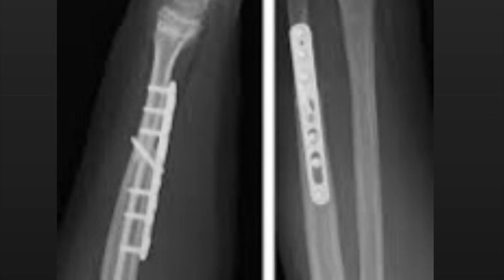It shows an example of a lag screw in the middle of the construct along with a long plate that was long enough to accommodate three screws both above and below the fracture. I think this is exactly the pattern that's going to be used for Jared Cannoneer's ulnar fracture. Thank you.